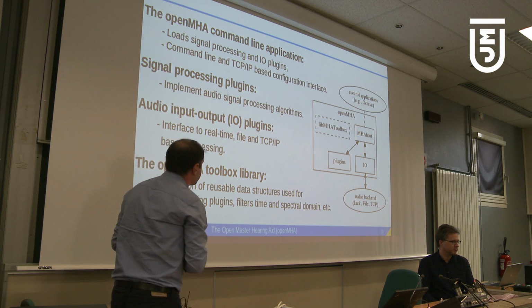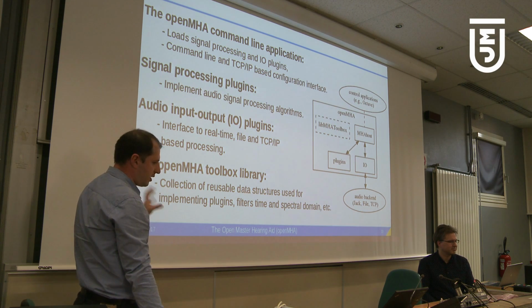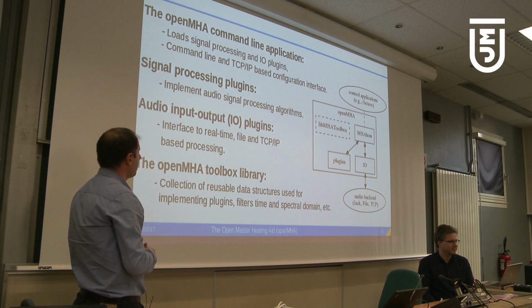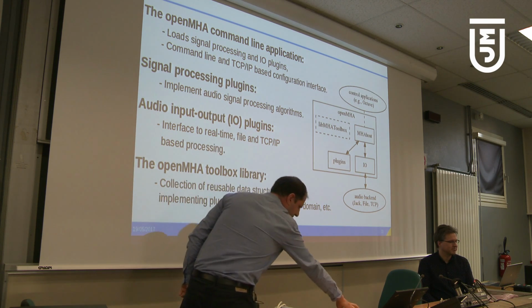And a crucial component is the openMHA toolbox, which contains, for example, what was mentioned before, the template for plugin development, but also other reusable data structures which are needed in signal processing applications.